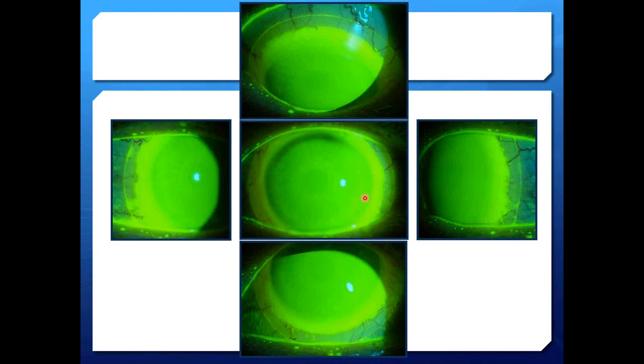If you have greater than 180 degrees of bearing or thinning, and you do the fixation change test, you're often going to see that bearing just doesn't go away, and it's because this is simply a high point, or we don't have enough vault in our limbal clearance zone.